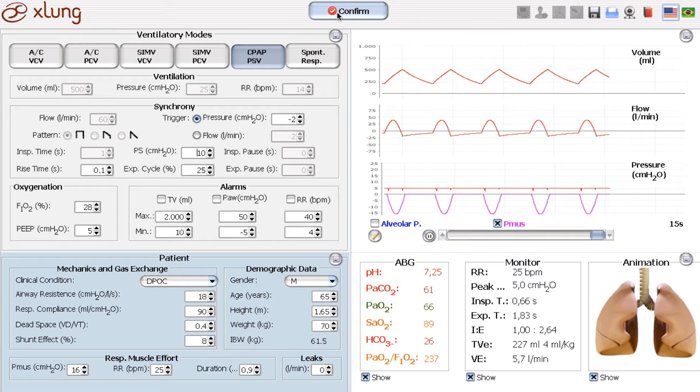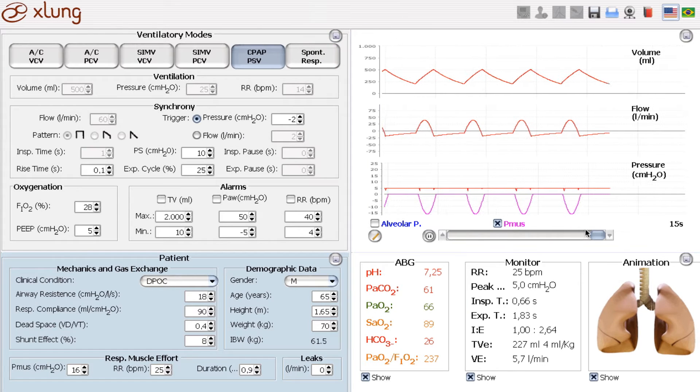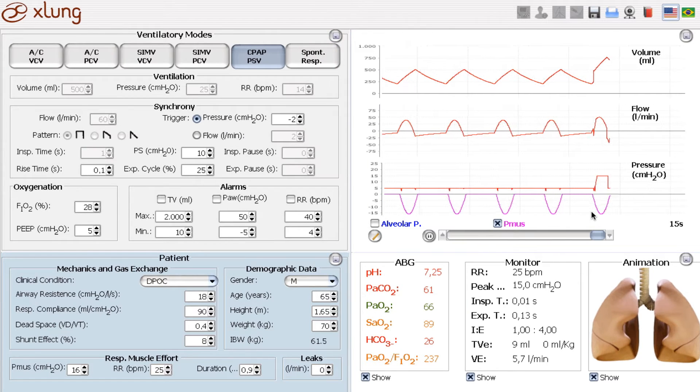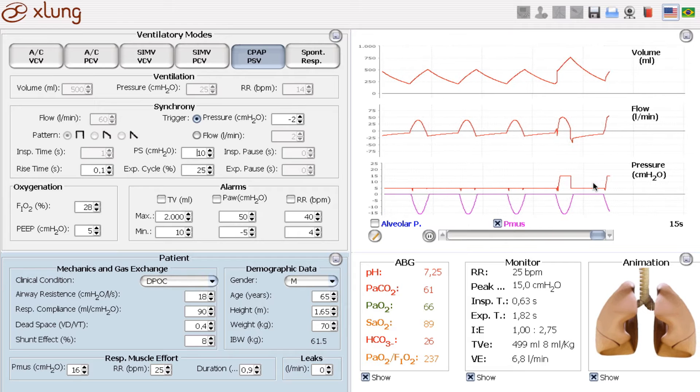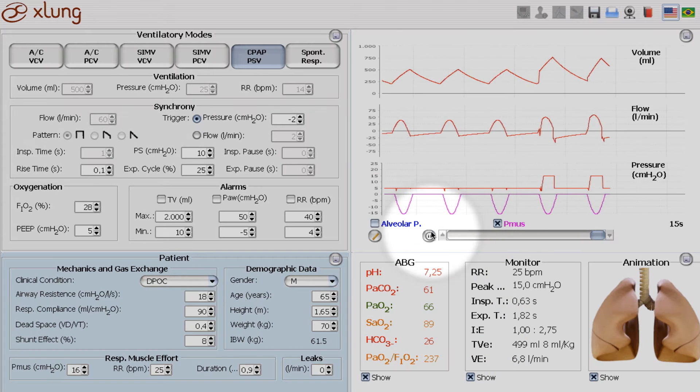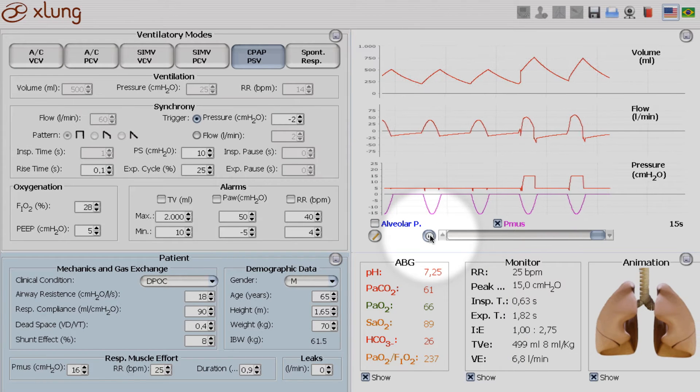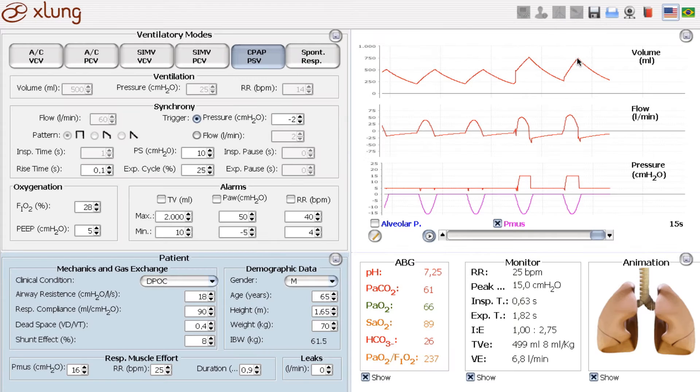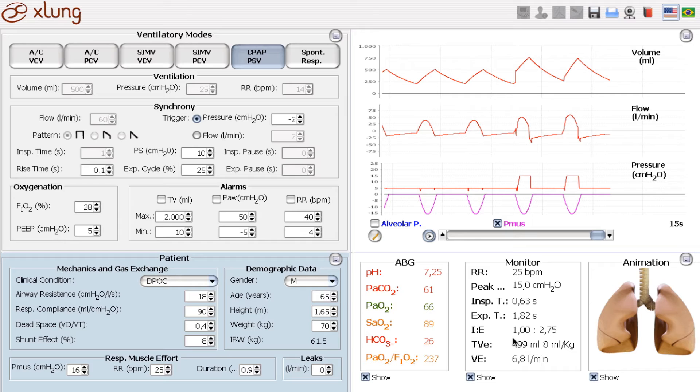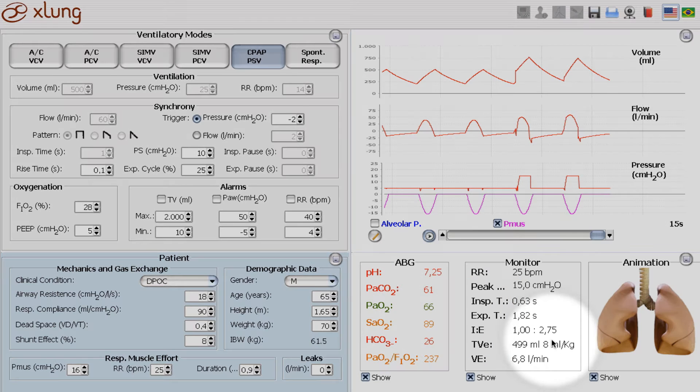Of course, now the ventilator gives him pressure support. Look at the tidal volume. I'll just freeze the system. Here's the tidal volume. Much more. Around 500 ml, 8 ml per kilogram.